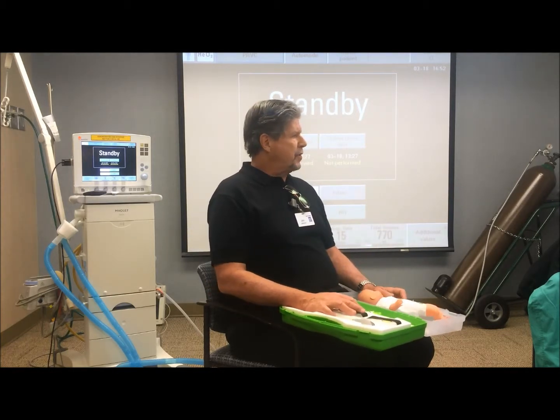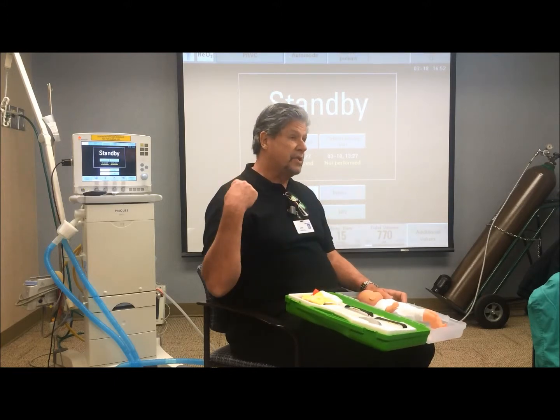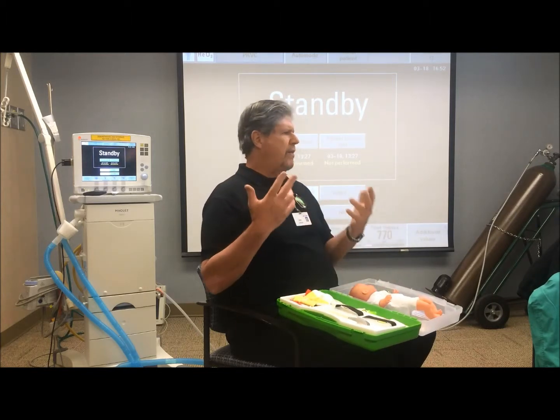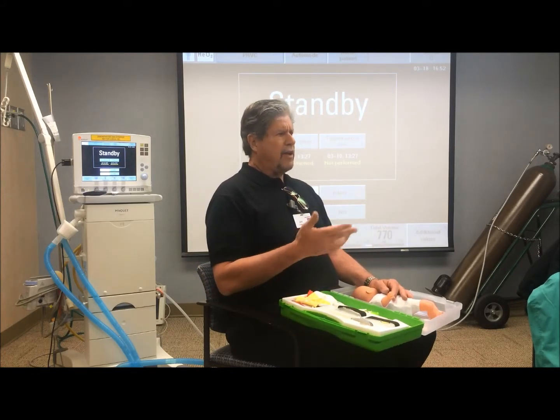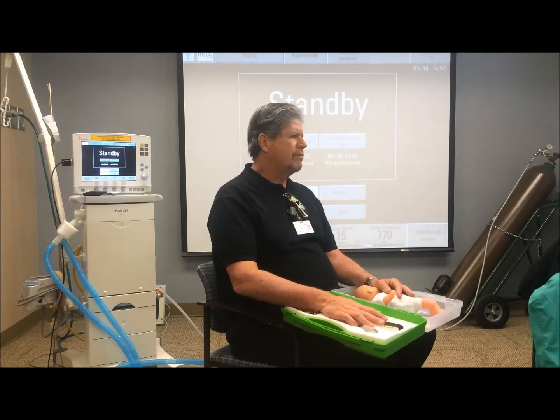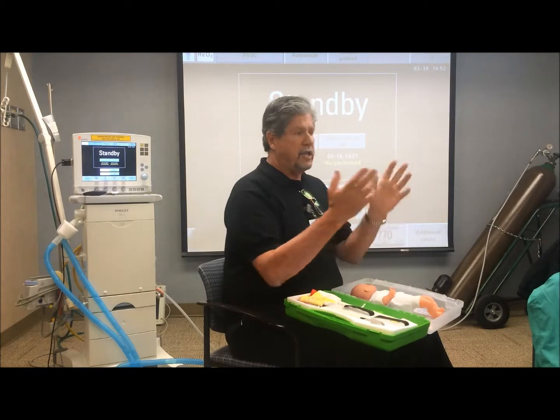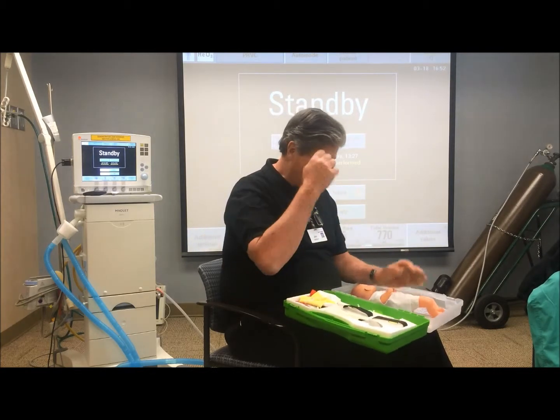I've been to a couple hospitals, I think initially it was actually Baptist, Winston-Salem. All they had was the RAM cannula, and then they'd go, we're having trouble, we got leakage or whatever with the RAM, what can we do with the ventilator? And I go, I don't think you can do anything with the ventilator, just try a different interface. And they go, oh, we don't have a different interface to use. And I go, you don't have any other prongs or any other thing that you can use for babies? No, we're just using that one RAM cannula for now. So eventually they got a different one, so they have different options now when they have difficulty.